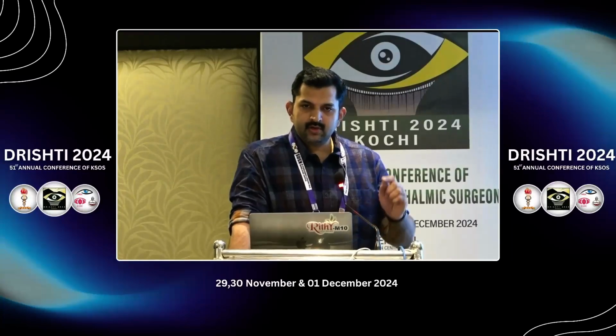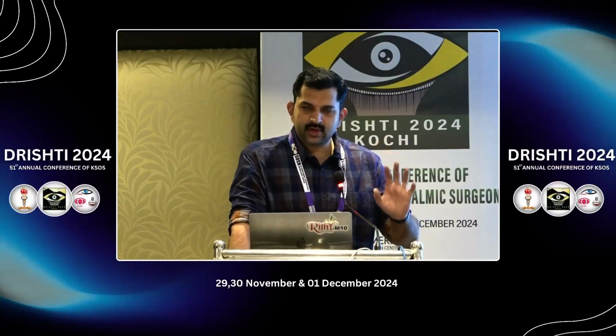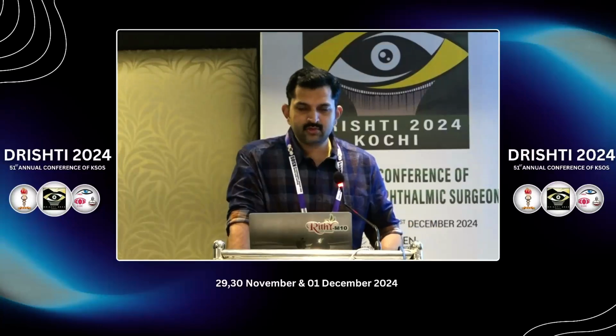Do we generally laser the hard exudates all that often? If it is a focal maculopathy, you can definitely see an aneurysm that can leak. In that case, if it is encroaching the fovea, you can laser it.